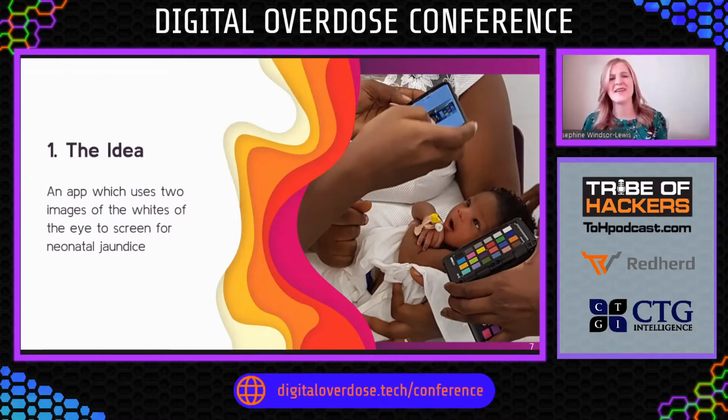I mentioned a pair of images here. There's a flash and a non-flash image. The reason we need to do this is because, as I'm sure you'll all be familiar with, if you sit under a blue light, everything around you starts to look blue. If you sit under a yellow light, everything will start to look yellow. That's the effect of ambient lighting, which can look really cool, but unfortunately isn't the best for accurate diagnosis.